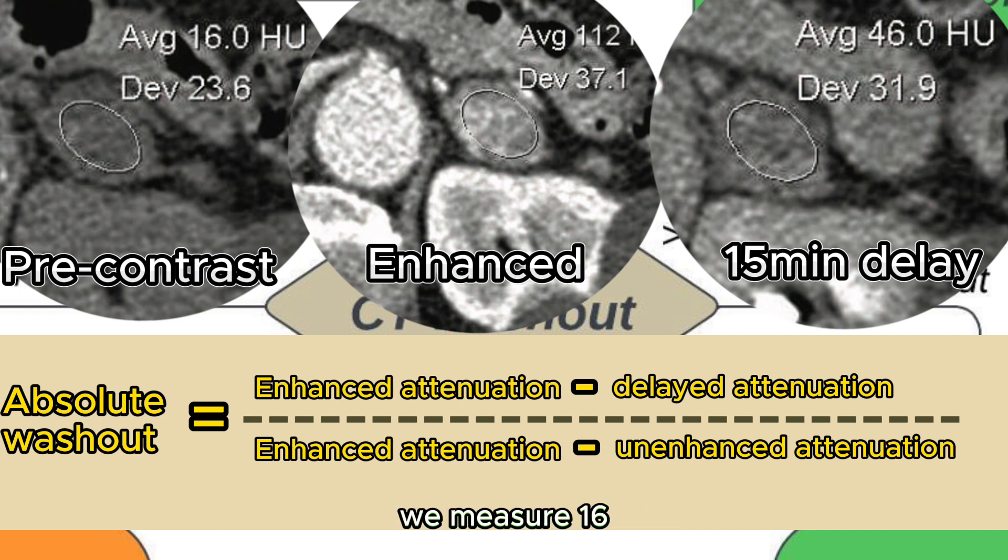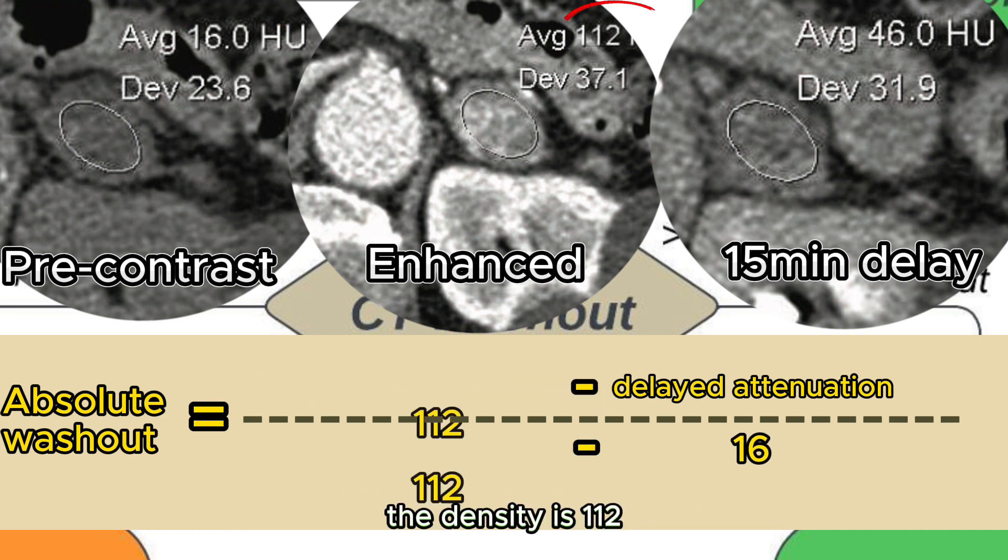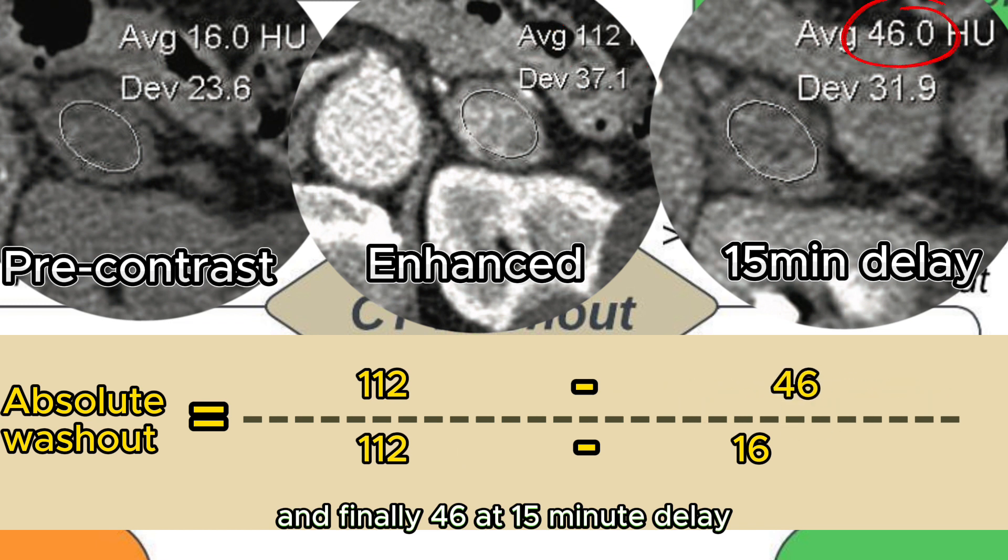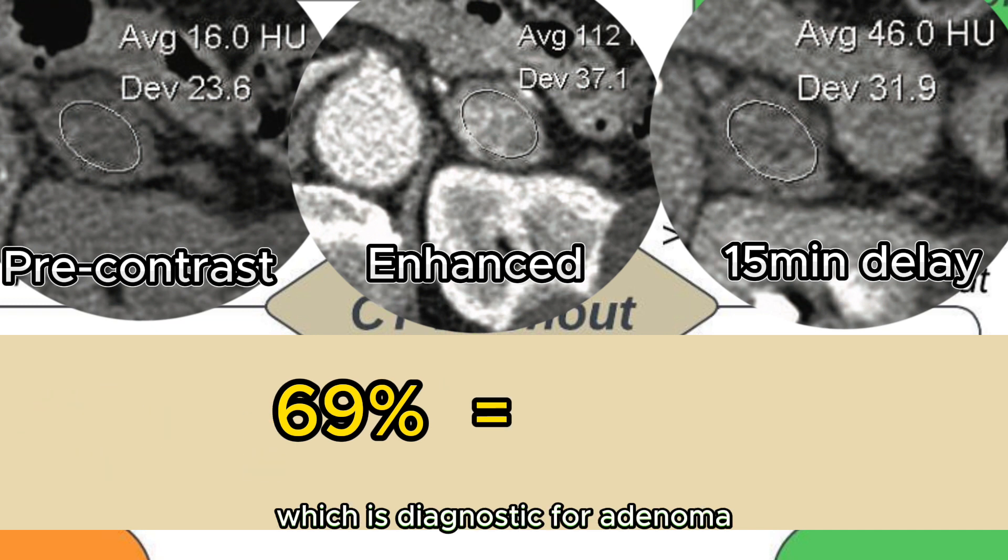Before contrast giving, we measure 16, during portal venous phase the density is 112, and finally 46 at 15 minute delay. This gives us a 69% washout, which is diagnostic for adenoma.